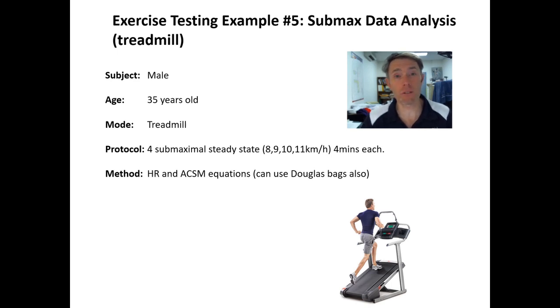So this is an actual test I did a few years ago. He wanted a program to help run the City to Surf, and so he's probably about 3 months out of there. And I said, well, he didn't want to do a max test, so I said, well, we'll just do a submax test, and that will give you quite a good load of data.